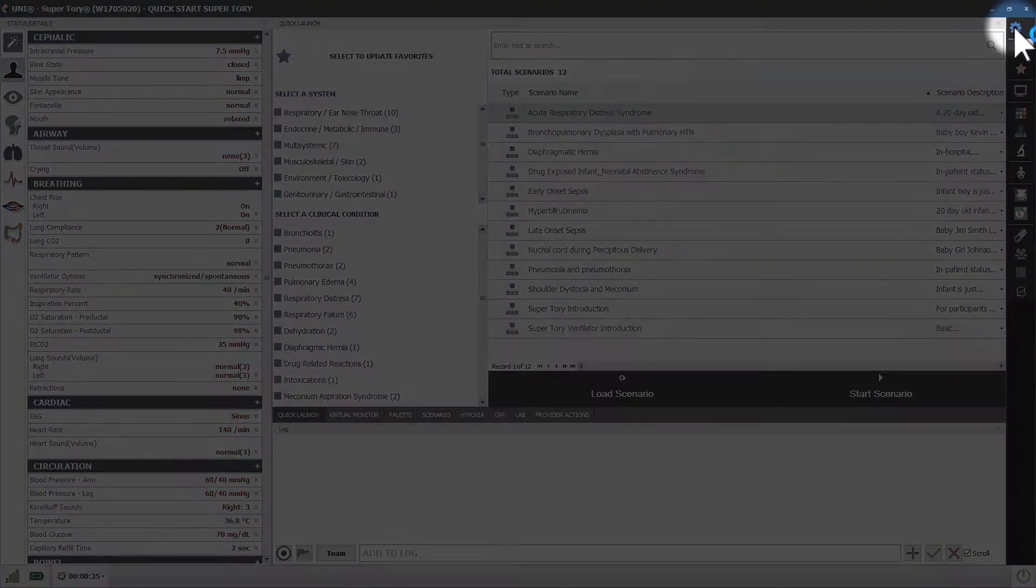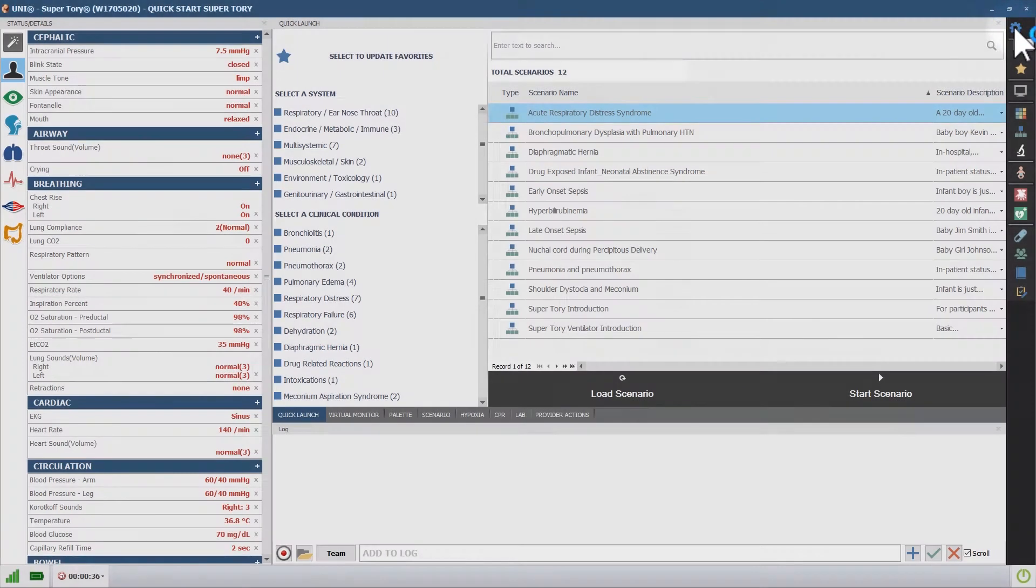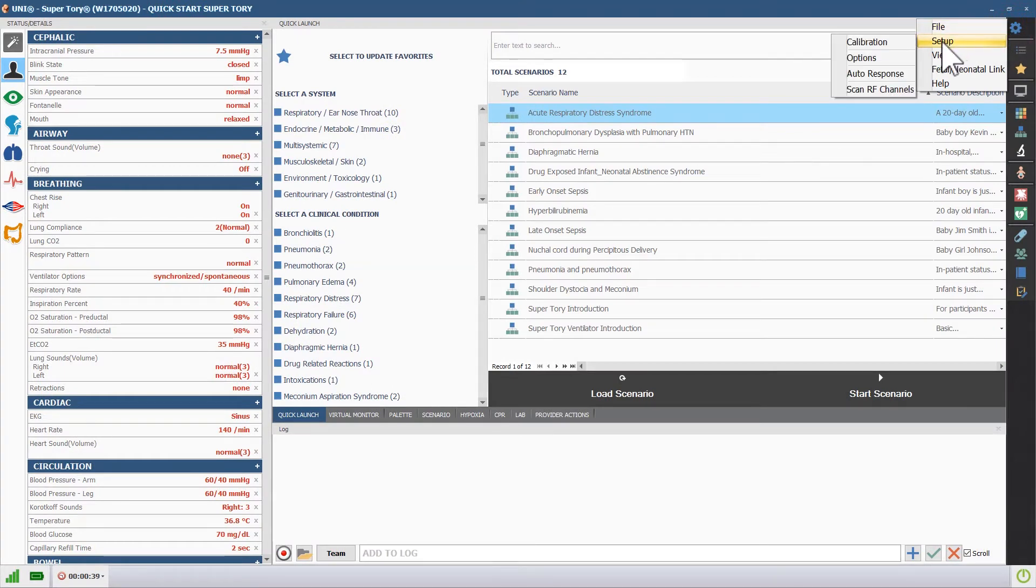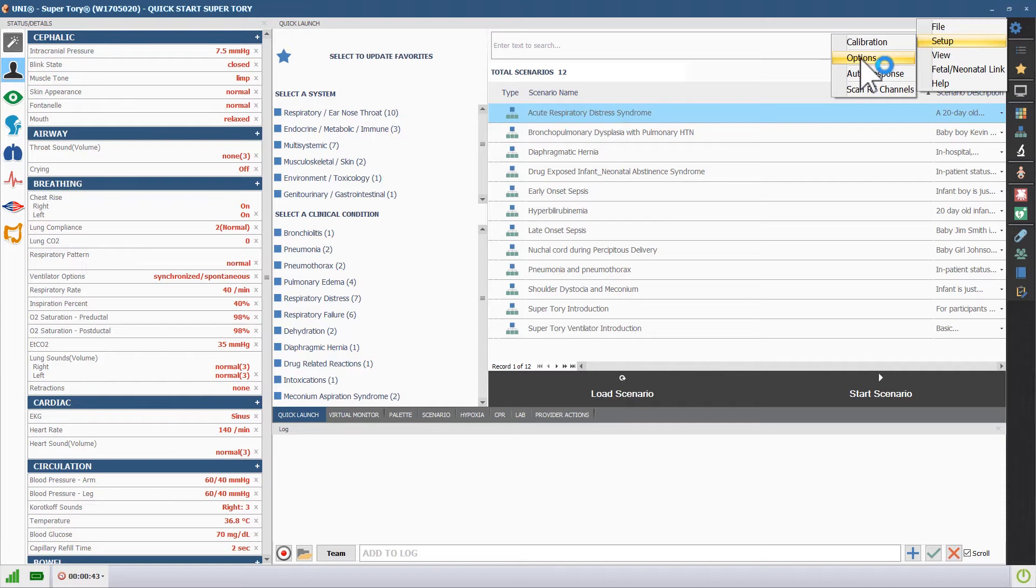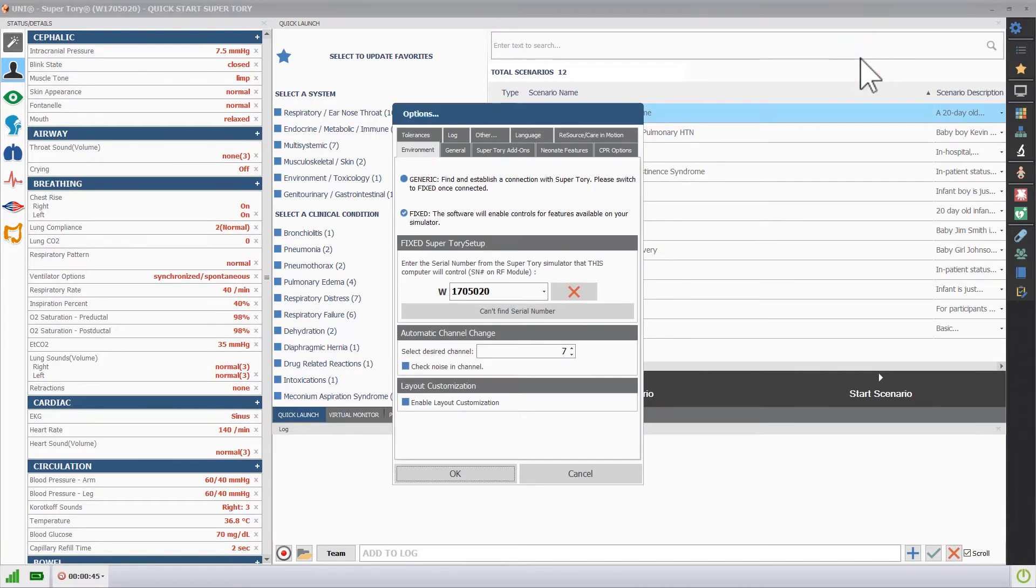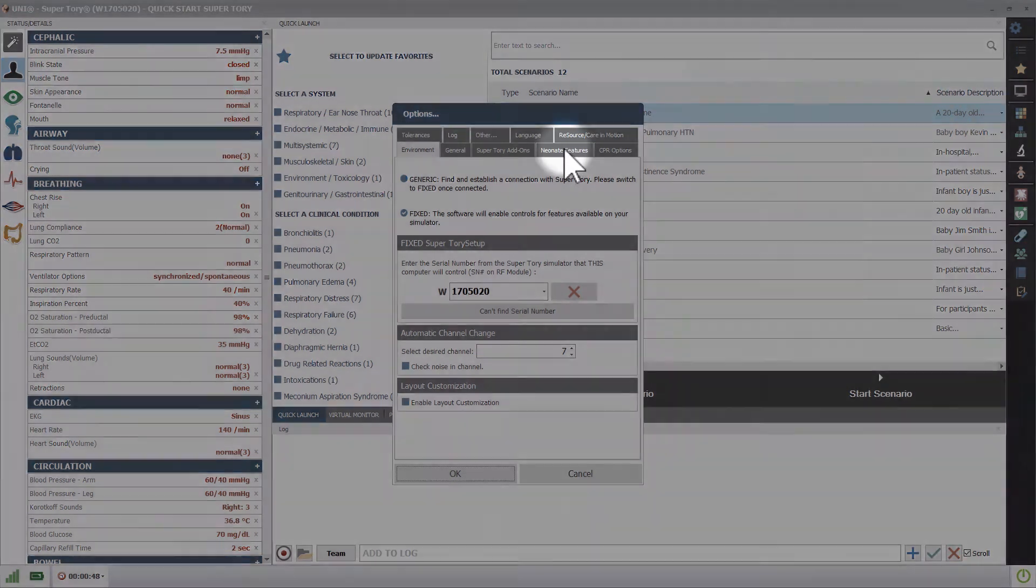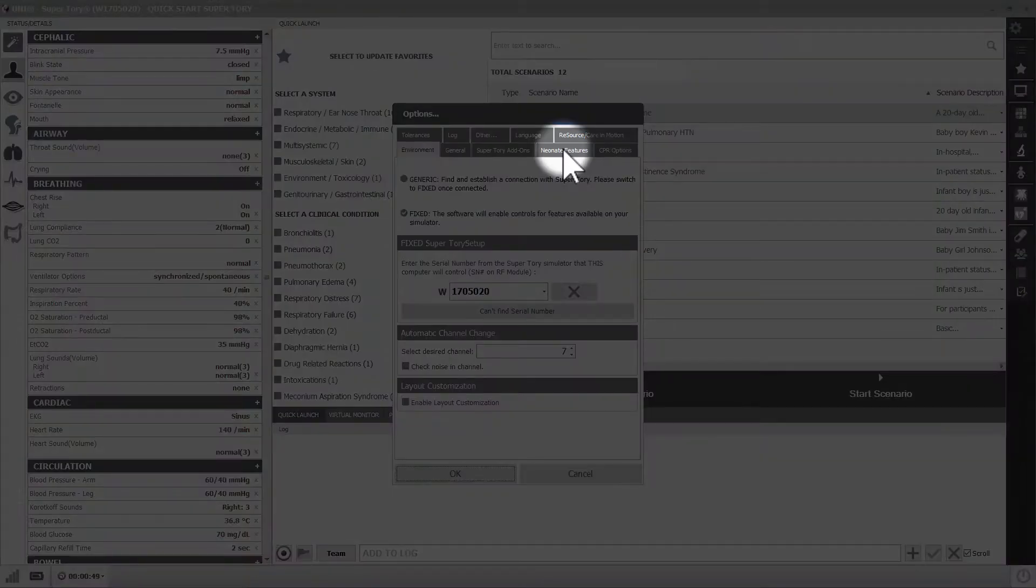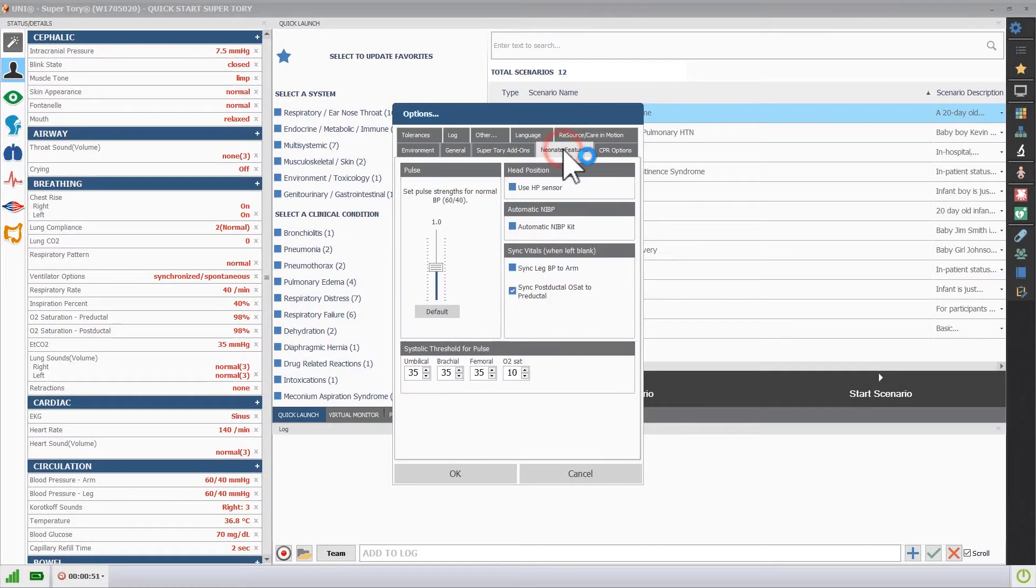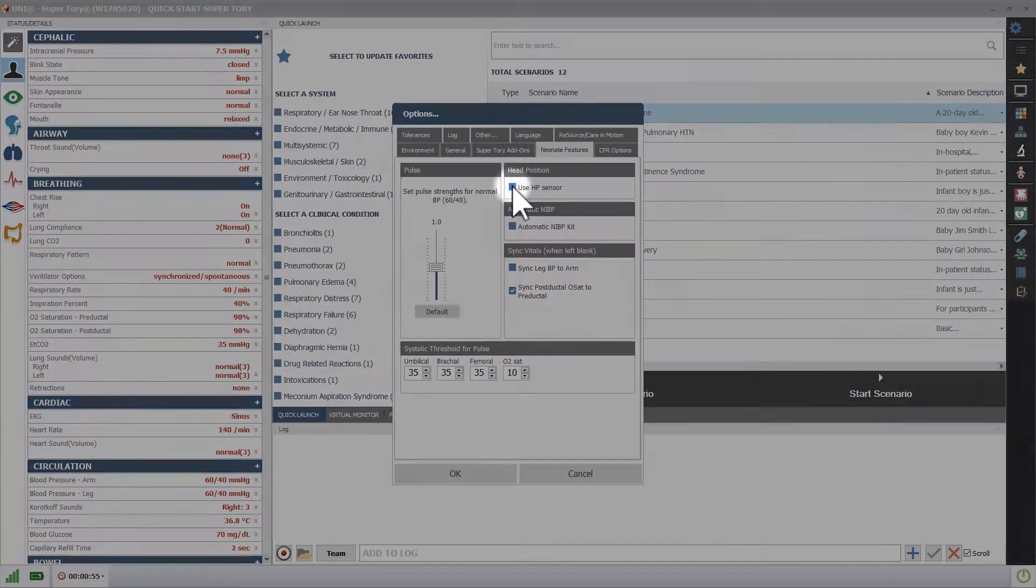Click the menu icon in the upper right, scroll over Setup, and click Options. Open the Neonate Features tab, and click the button next to Use HP Sensor.